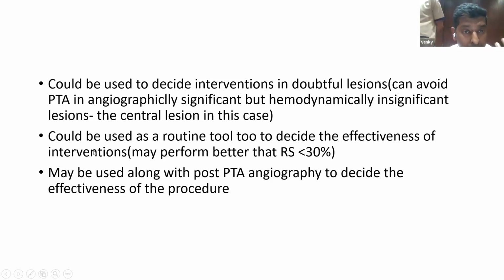Or you could use it in tough cases, like in this case. Angiographically, the central lesion appeared significant, but after the pressure monitoring, there is no difference in gradient at all, which means the lesion was not significant. You need not have touched the central lesion in the first place. So this could be a valuable tool in regular vascular access angioplasties.